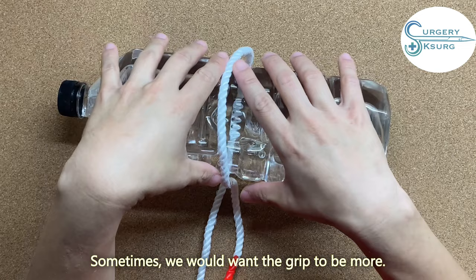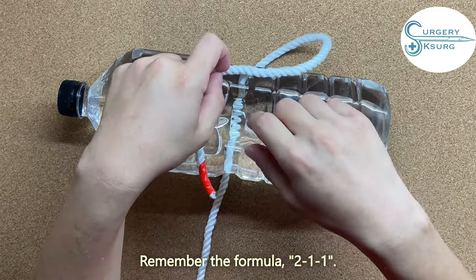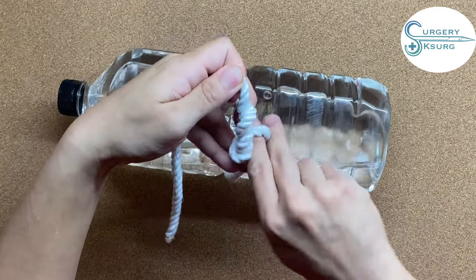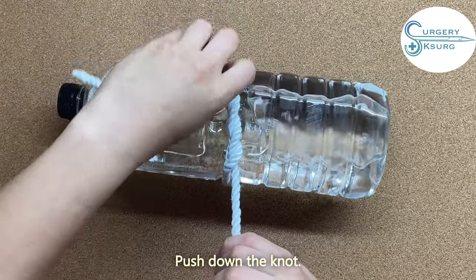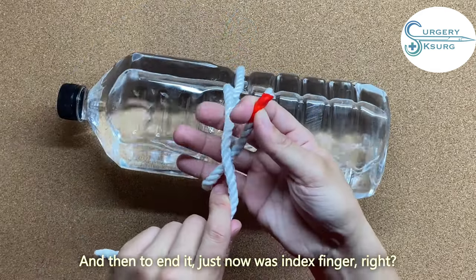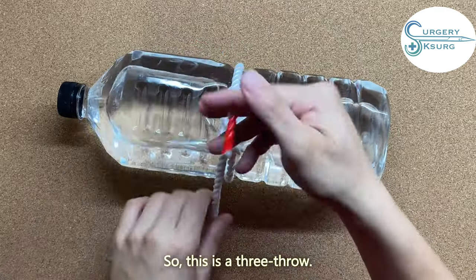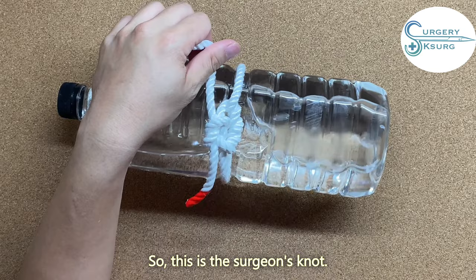Sometimes we want more grip — then we use a surgeon's knot. Remember the formula: 2-1-1-1. You do like this: one, two — and remember to push the knot down rather than go up. So this is two throws. Then to end it, just now was the index finger, now use the other finger — and you can see it is square. This is three throws. After the third throw, put the fourth throw. That is a surgeon's knot.